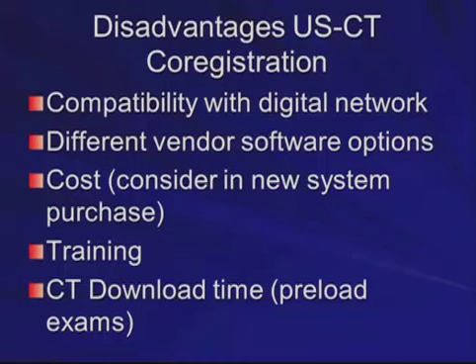Second of all, different vendor software options differ. And so depending on how you're going to use it, it's really important to demonstrate it, to use it in your department, at least for a short time, or look at it, because some types of co-registration are going to be better for interventional purposes and others are going to be better for diagnostic purposes.